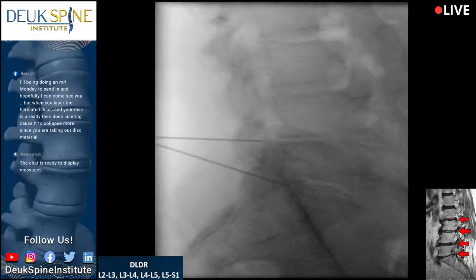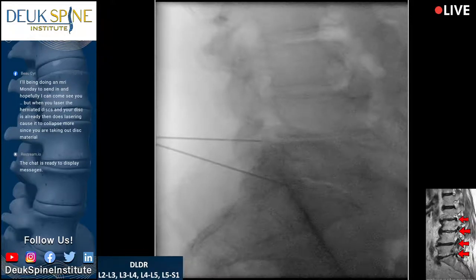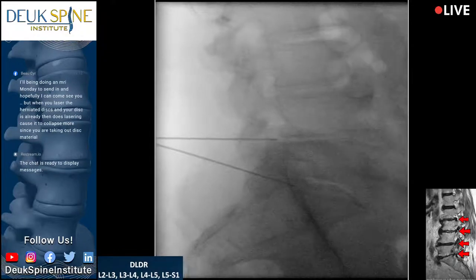You okay? He's having back pain, but he's right not there. Right at the site of the thoracic. Well, this is one of your bad discs, that's for sure.